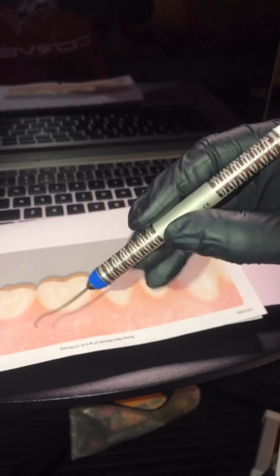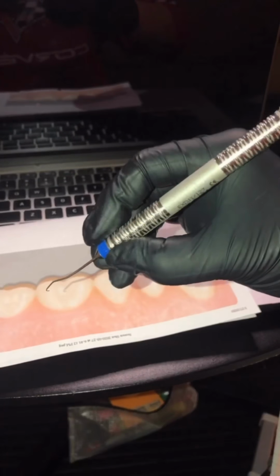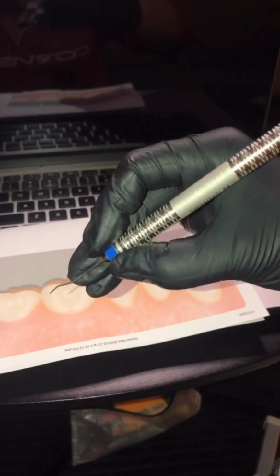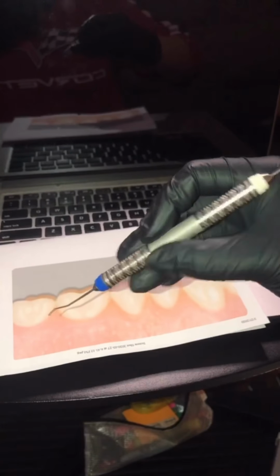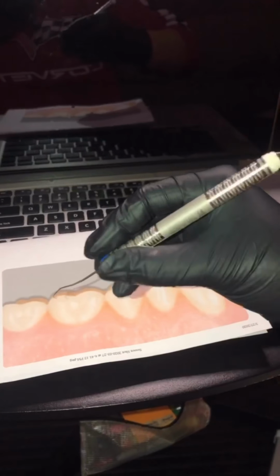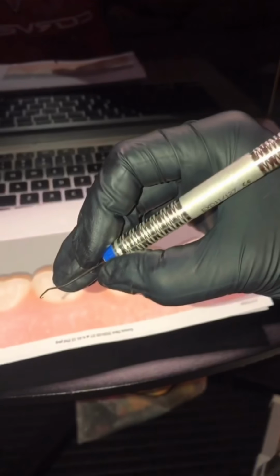And then as you work into more anterior surfaces, you can kind of inch up and make sure that you're a little bit closer. So again, you can telescope out to reach all the way back there, or you can pull it in closer to make sure that you are able to get everything. That's my modified C.